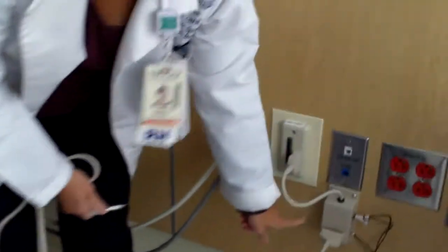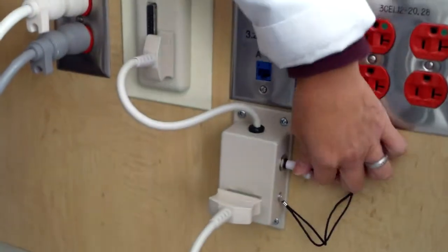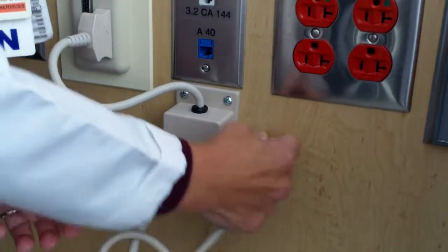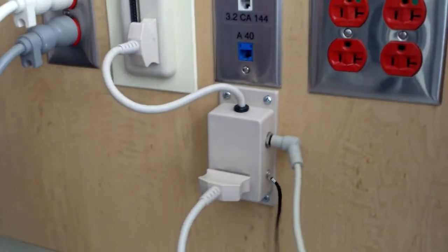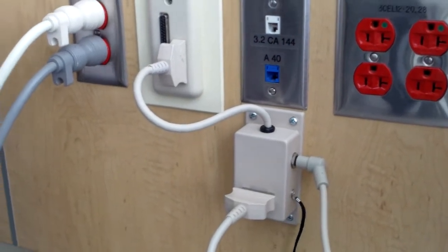Alright, so let's put it into the wall. It has to go into the call system. This is the call system where we plug in the bed and the call light. You just pull out this pin on the side, and then you're going to put the other side in like this. Okay? So you'll want to let the clerk know because it's going to alert them that it's in.